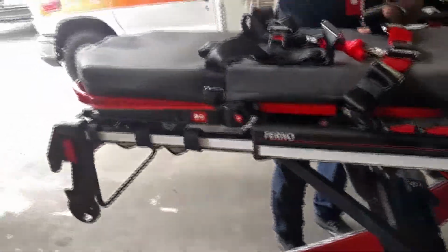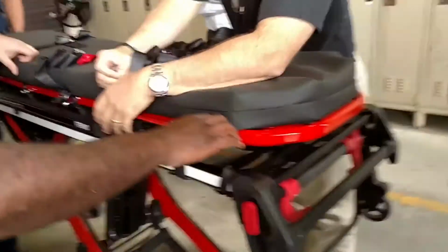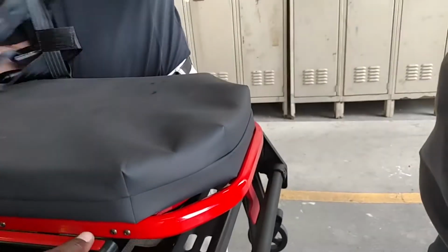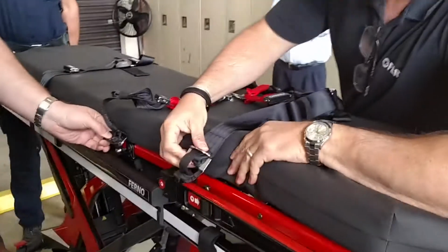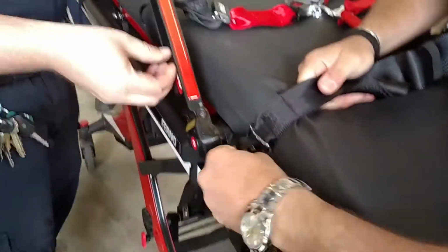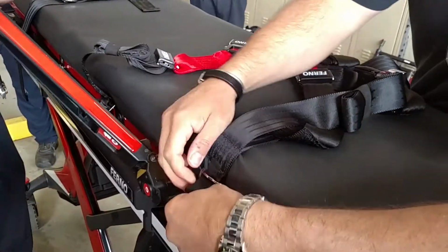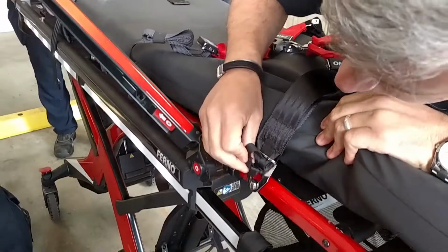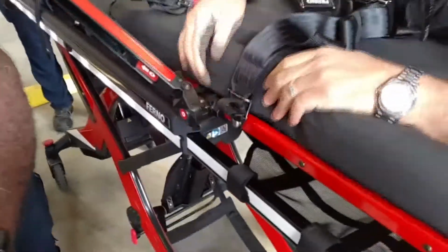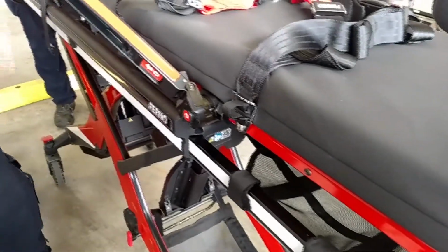There's no quick release of the seat belts in the event they're grossly decontaminated and we have to get them off to clean. So this guy right here. Okay, fantastic. I kind of like these too. Yeah, the ergonomic press. They can come out and you can rest their arm on it to start an IV or something. You're exactly right. That was kind of the thought process, as well as if you had to accommodate a larger patient. You can push them out.